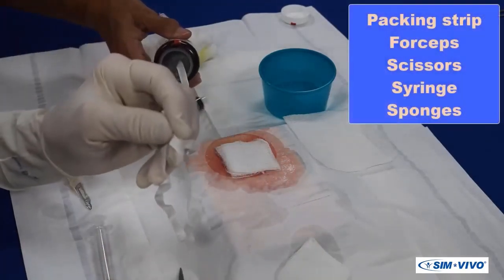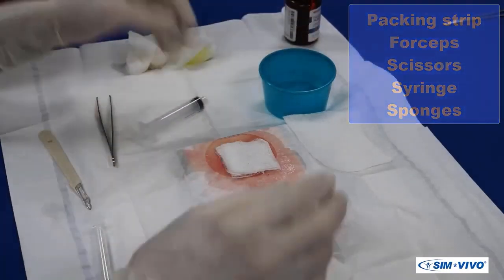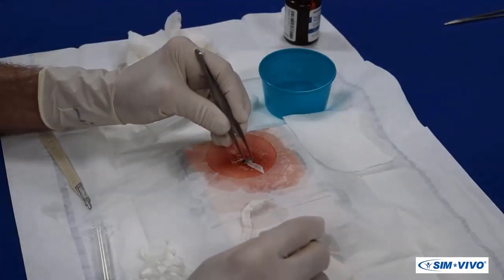A continuation of this scenario will demonstrate the continuing care after an incision and drainage, which will require packing removal and replacement. The only necessary supplies are a length of packing strip along with forceps, scissors, a syringe, and sponges. Expose the abscess and remove the previously placed packing with the forceps.